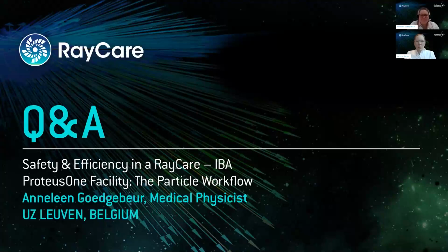That was that question. We'll see how many more we have time for, but how much downtime have you had caused by RayCare since you went live? Oh, I would say our RaySearch software environment is generally stable. So I would say nearly perfect uptime in terms of stability. Maybe something worth noting is that we also perform our morning QA through RayCare. So if there's a service restart needed or a specific Citrix issue, for example, it will get picked up early on in the morning, and that sporadic server restart will already be performed prior to the first patient arriving. So pro tip, definitely include RayCare as part of your morning QA.